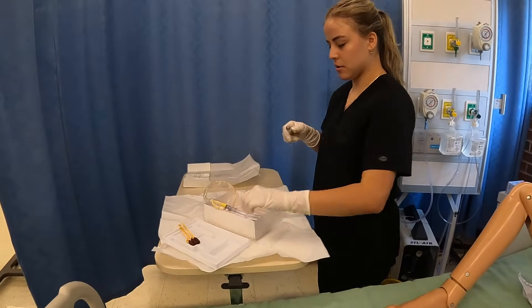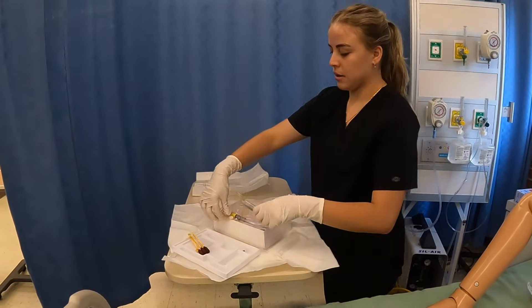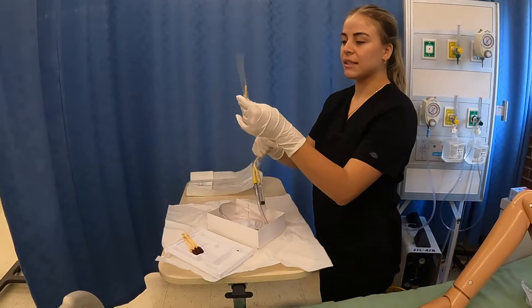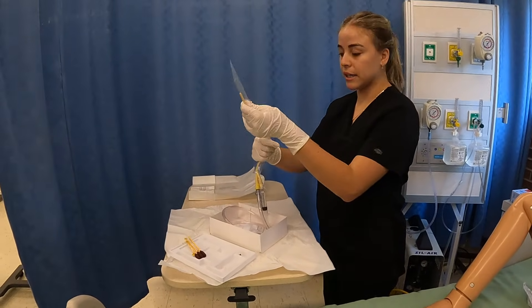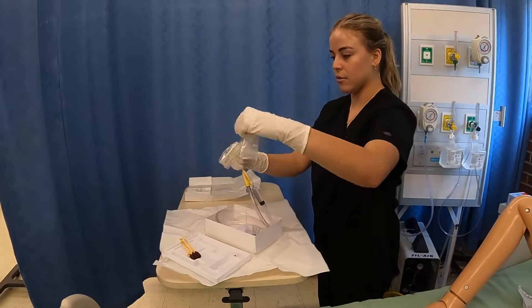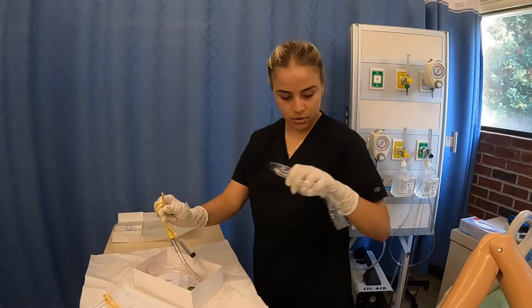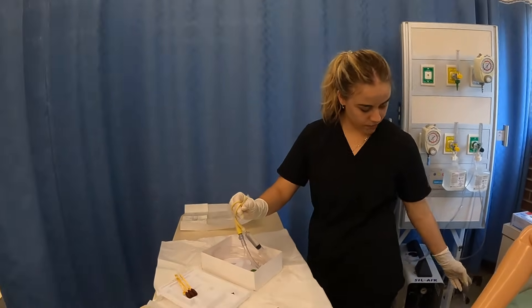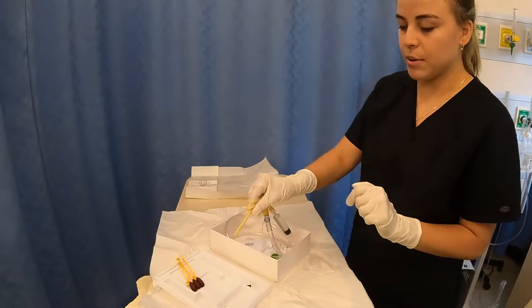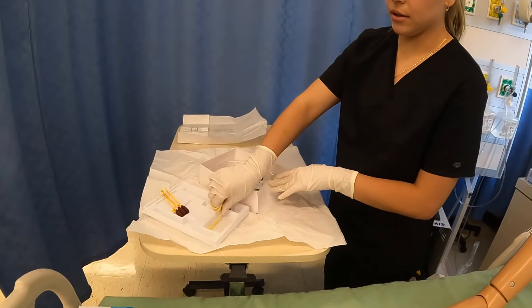Now I'm going to get my saline solution and connect it to the tubing. Removing this plastic part, we want to be careful that it's not going to flail around everywhere — we want to keep it sterile. I personally like to, as I'm slowly pulling it out inch by inch, coil it around my fingers. From this point, I do like to get the end of the tubing and coat one to two inches of my catheter with the lubricating jelly.